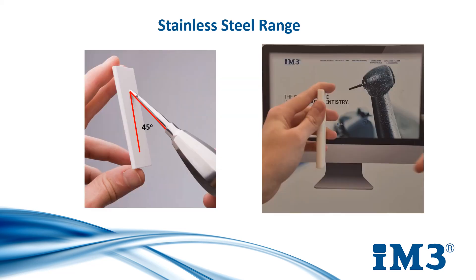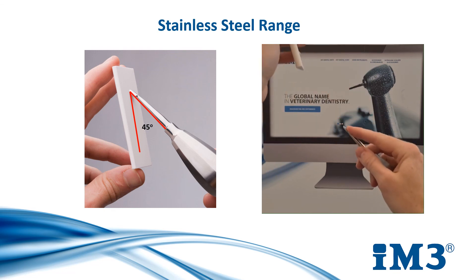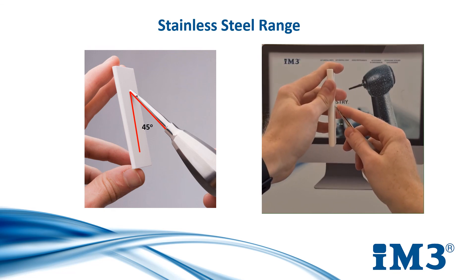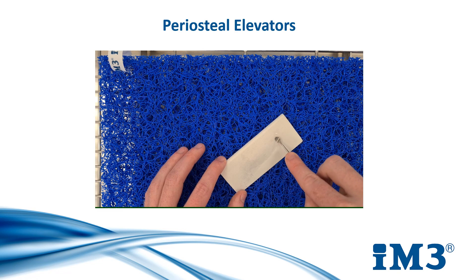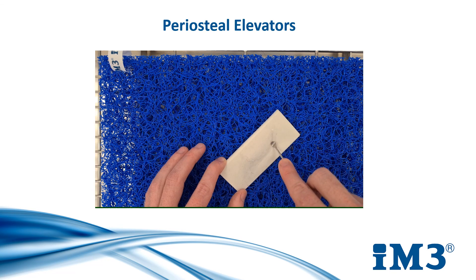The stainless steel variety of elevators and luxators are sharpened using a stroke technique. Hold the sharpening stone vertical and angle the inside of the blade at 45 degrees. Move the sharpening stone upwards against the blade in one motion, approximately two to three strokes after each use. Finally, we have the periosteal elevator that is used to lift gingival flaps. This is sharpened using the smiley face technique as for the ergo range.